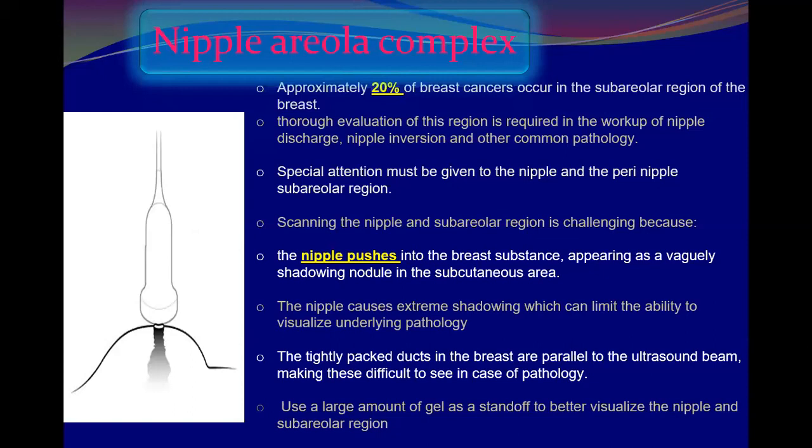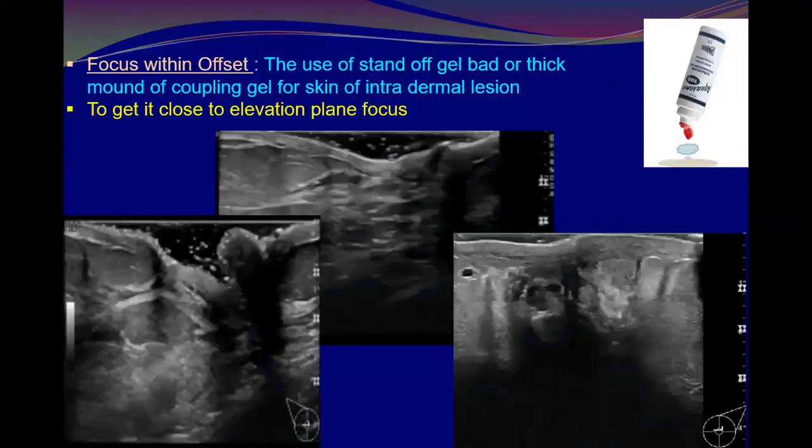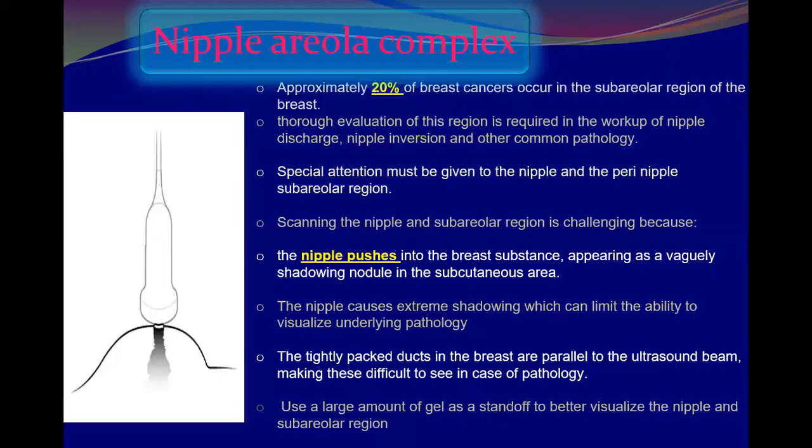We mentioned that one of the important techniques to visualize the nipple and subareolar region is the standoff gel pad, or focus within an offset. This is one of the techniques importantly used for evaluation of the nipple areolar complex.